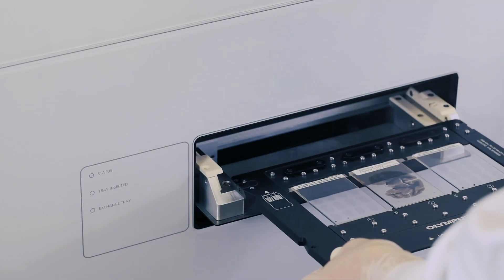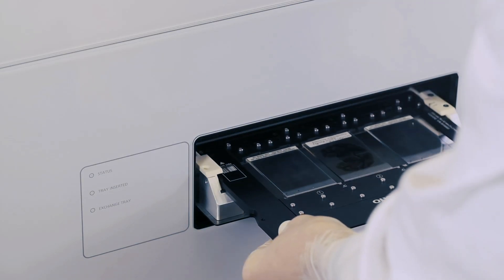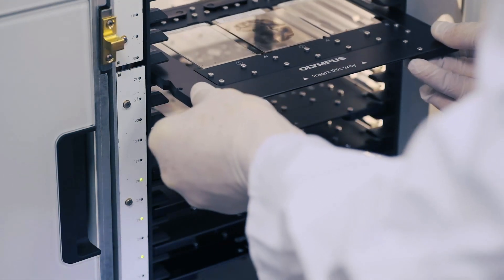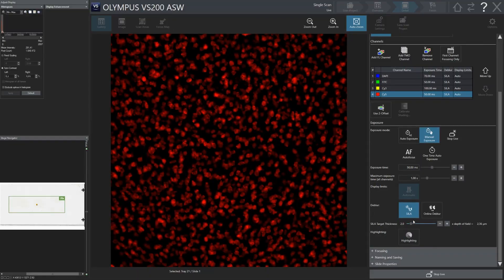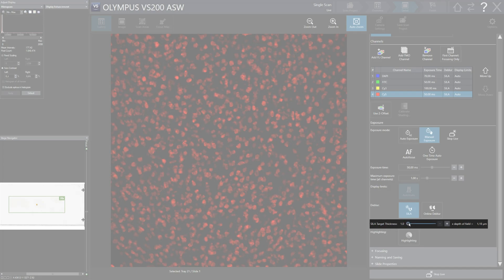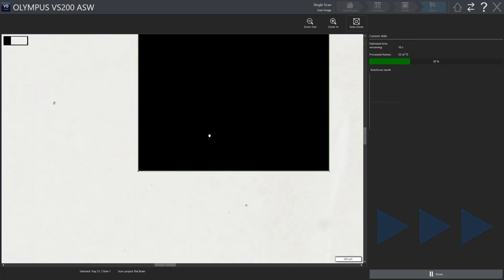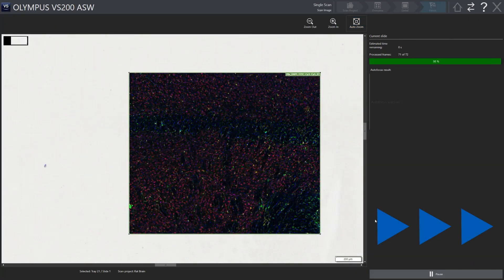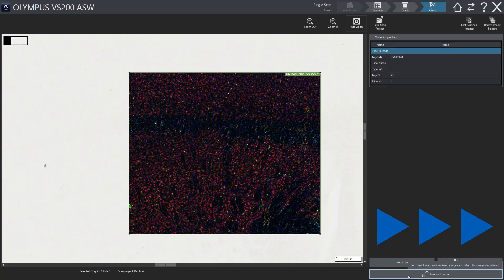Just insert the slide manually or use the loader. Start the VS-200 optical sectioning software and adjust the desired optical thickness. Start the application to acquire your experiment image.